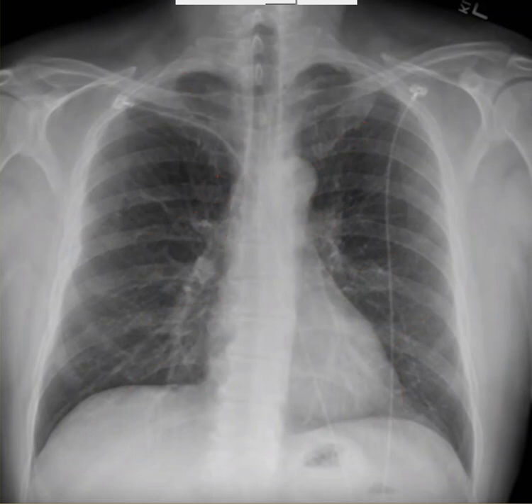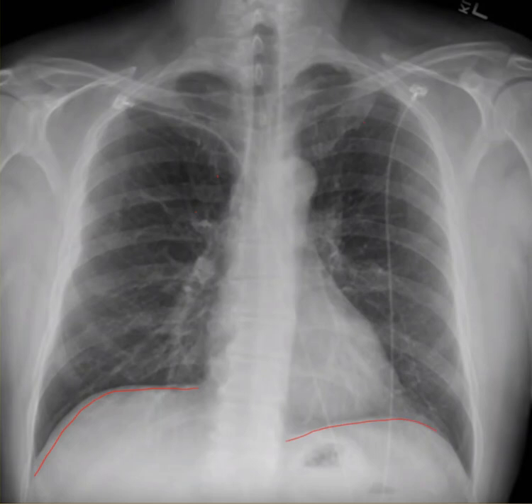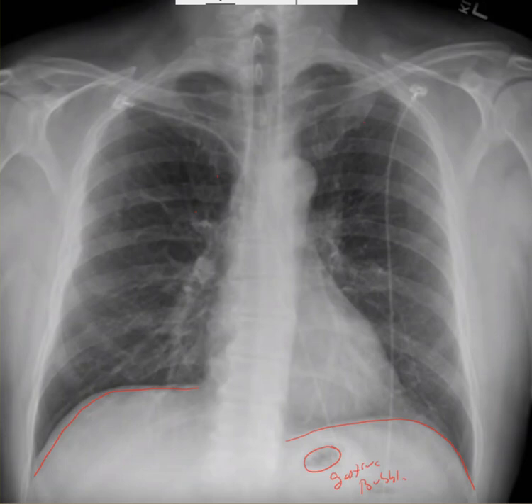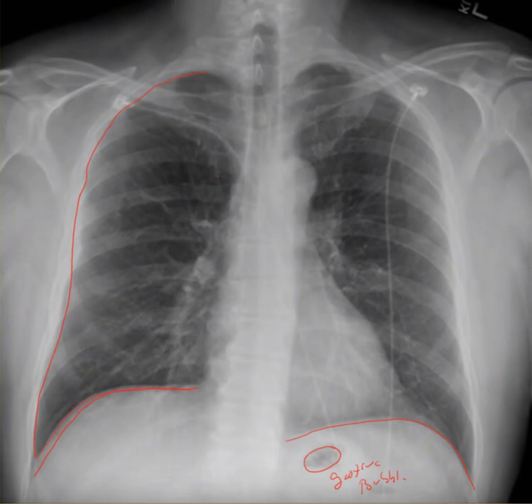On to the diaphragms. You can see the right diaphragm right here, sitting on top of the liver — it's usually normally higher than the left diaphragm, which is right here, sitting on top of the stomach. This dark circle here is a gastric bubble. The pleura goes out to the edge in a normal patient. Of course, if you have a tension pneumothorax or pneumothorax, it's not going to be out to the edge.